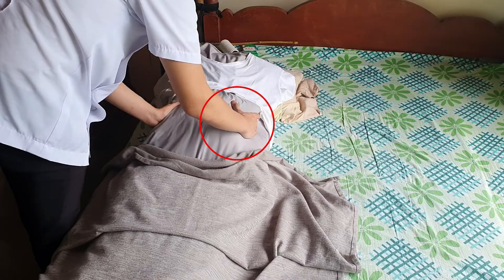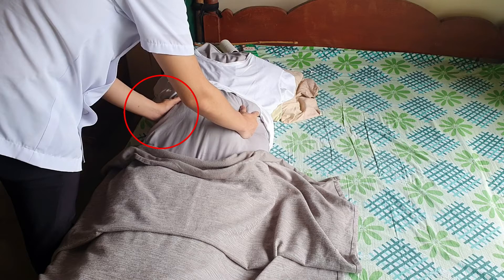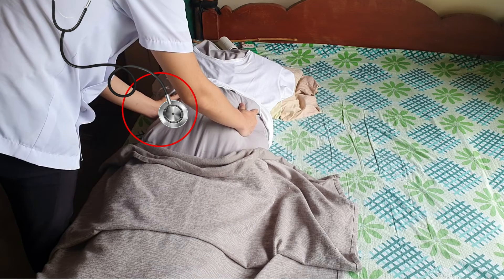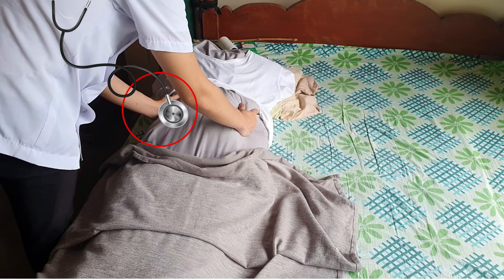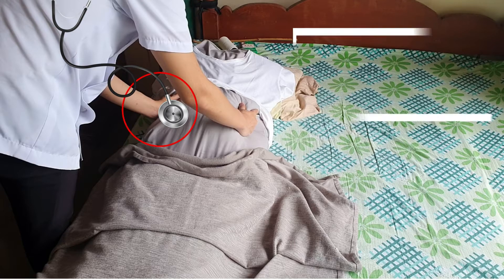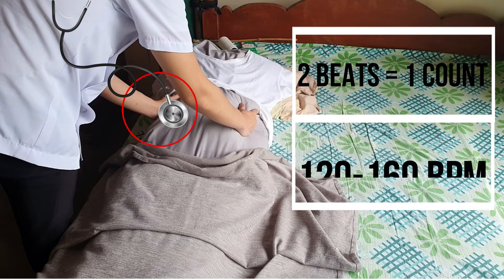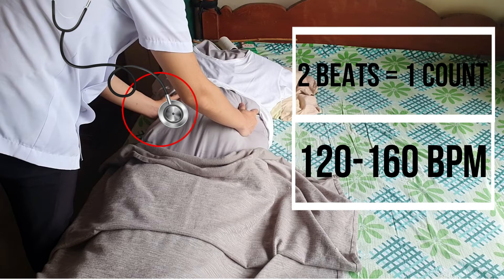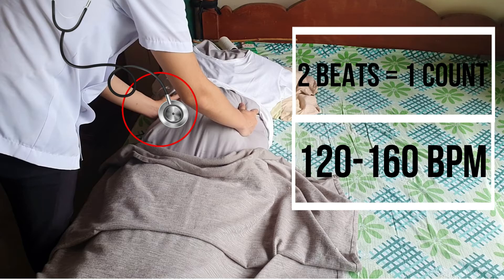Perform Leopold's maneuver until you reach the second maneuver, or the umbilical grip, in order to locate the fetal back. Place the diaphragm of the stethoscope onto the client's abdomen where the fetal back is located. Remember that 2 beats are equal to 1 count, and normal results should be in the range of 120 to 160 beats per minute. Below or above this range indicates fetal distress.